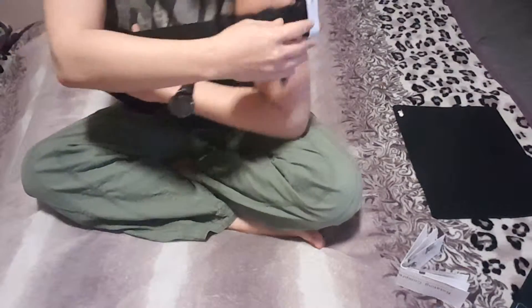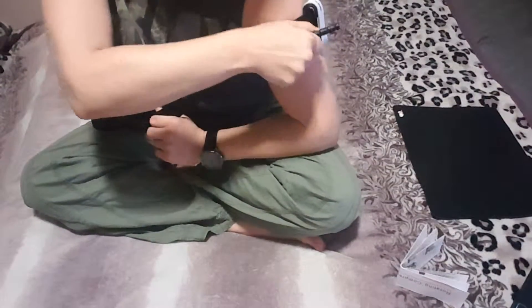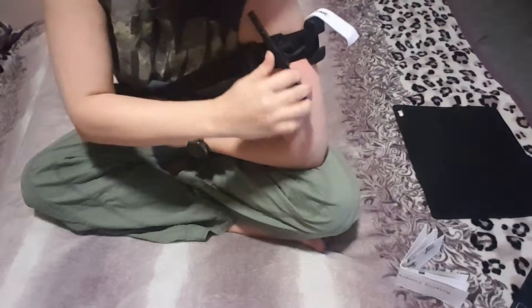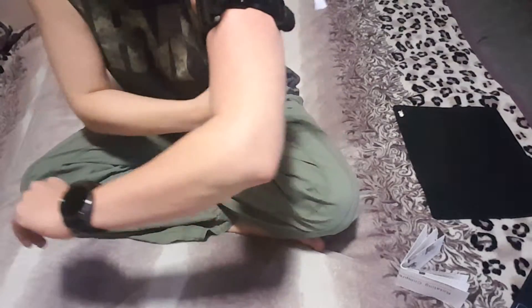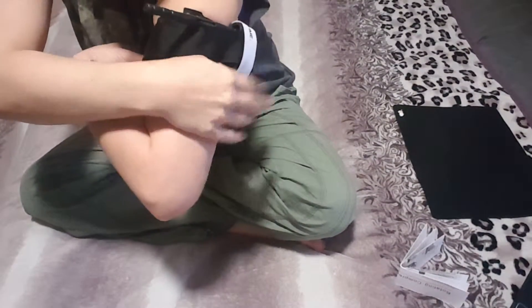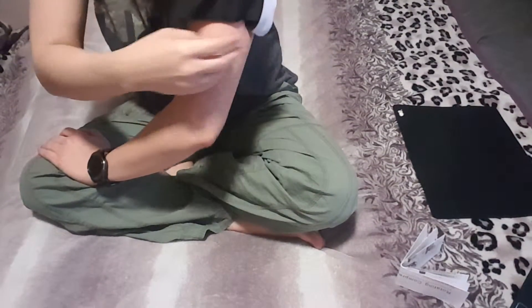I'm going to hold this against here while I spin this out as many times as possible until you see the bleeding has stopped. This can be done to yourself — it's better than somebody else doing it. Something I find tricky is this Velcro because it keeps flapping back over on itself. So now this is going to get stuck under the opposite one. I'm going to bring this around, go across, and then close it off. The option is still there to write everything you need to. You can adjust a little further to make it easier to write, though in an emergency you're not really going to be able to do too much anyway.